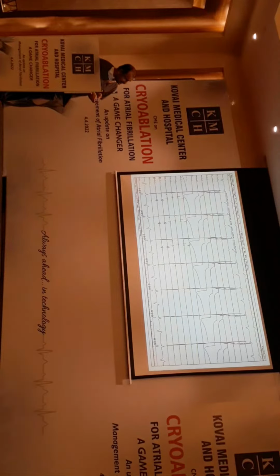So you can see here again, there are a lot of potentials which you are seeing in the pulmonary veins, and it's completely gone. In one fine movement at around maybe 25-30 seconds into isolation, the pulmonary veins have become silent. This is a sign that pulmonary veins have got isolated. So you are no longer having any signals recorded from the pulmonary veins. So you have got a RSPV also isolated.